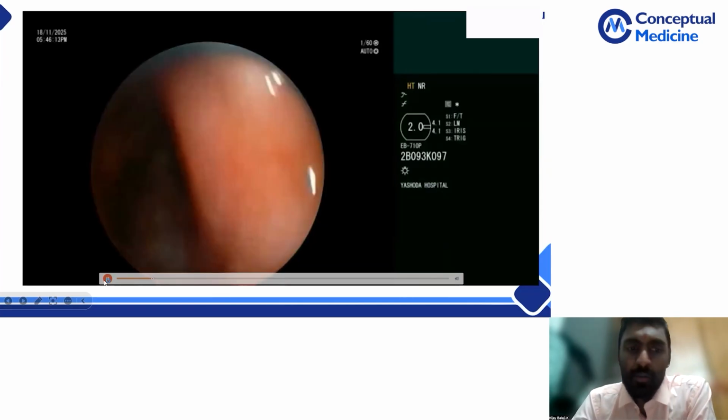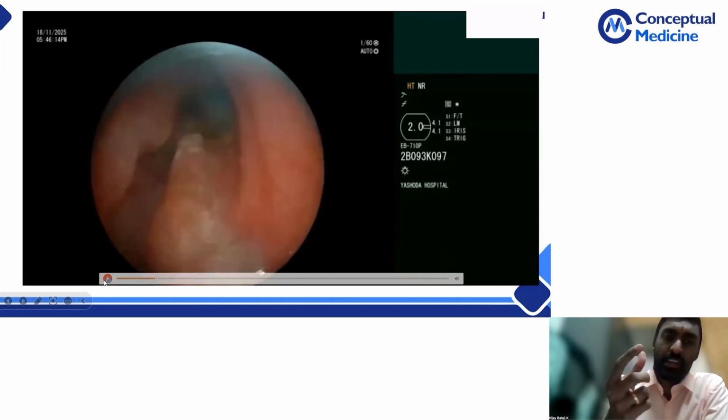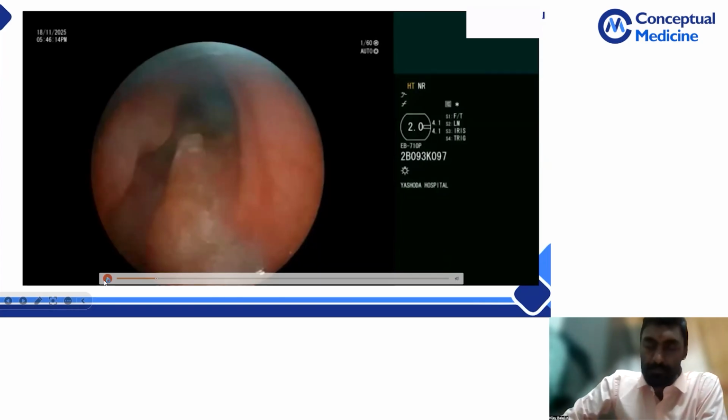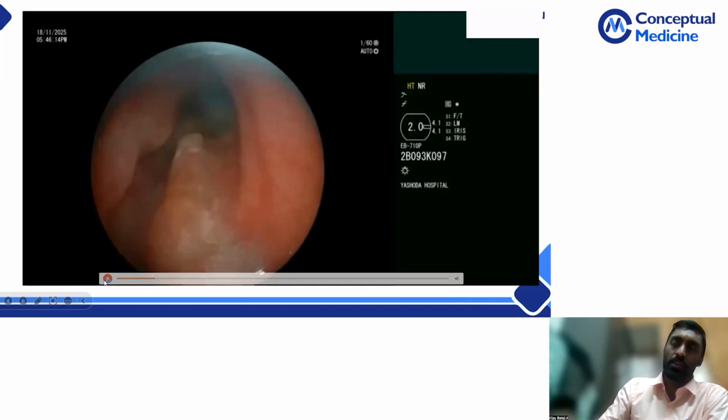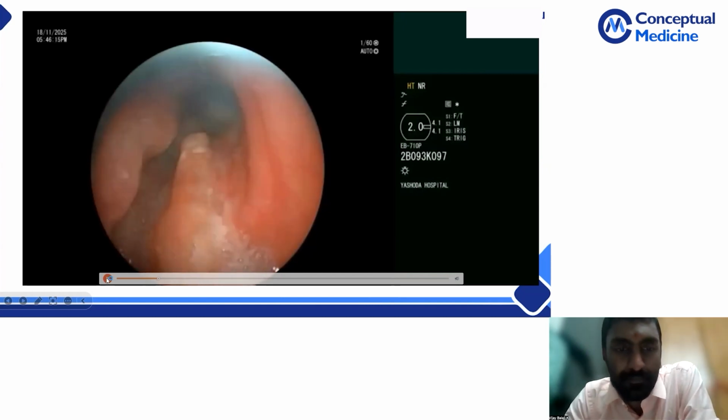Fistula here. So what people have done in the army, right, is they've even used an ASD closure device. If it is a very large opening, and let us say a stent cannot be placed, let us say if it is higher up, then it is very difficult to place a stent just below the subglottic area. In those instances, you can go in with the bronchoscope and put in an ASD closure device. You have an outer part which has a bigger ring and an inner part that has a smaller ring. Then you place that there and fix it up there.